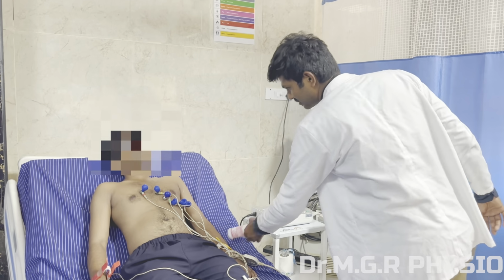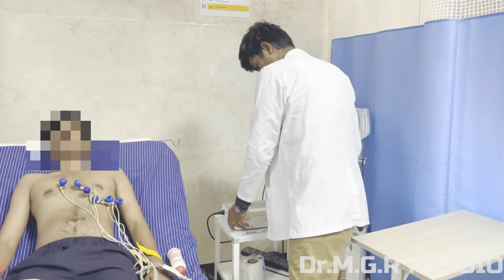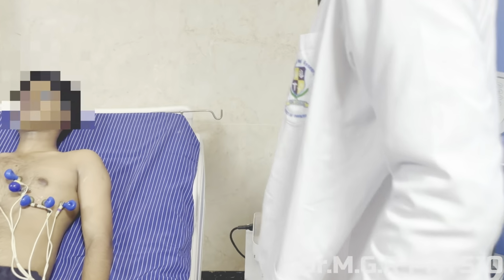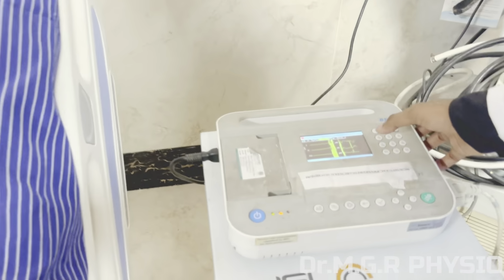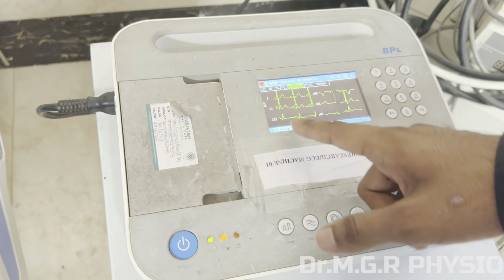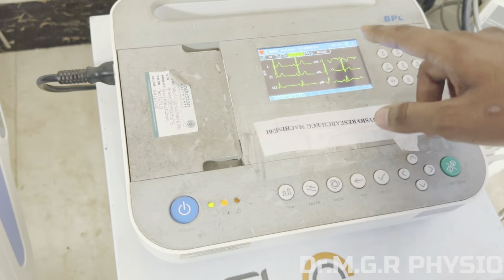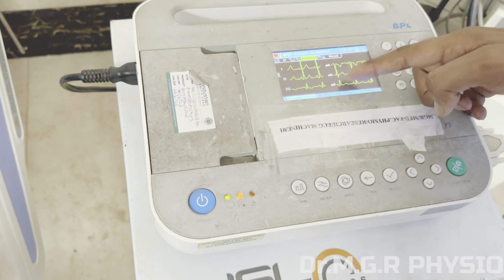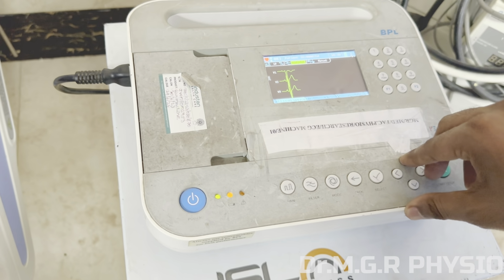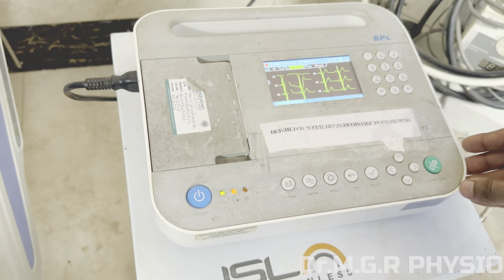Once you have placed these, you start with the machine. You power on the machine, and you can visualize the waveforms here. These are leads 1, 2, 3 and the augmented leads. Leads 1, 2, 3 are called Einthoven's leads. AVF and AVL, these augmented leads, are called Goldberger's leads. When you want to visualize the precordial leads or the chest leads, you shift leads, and you can see V1, V2 to V5, V6 here.